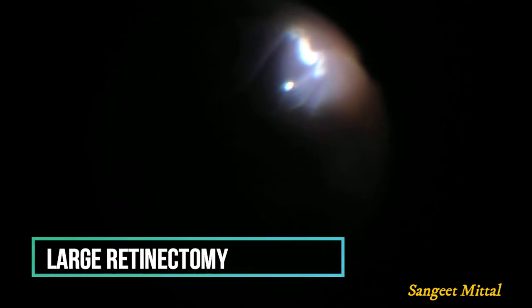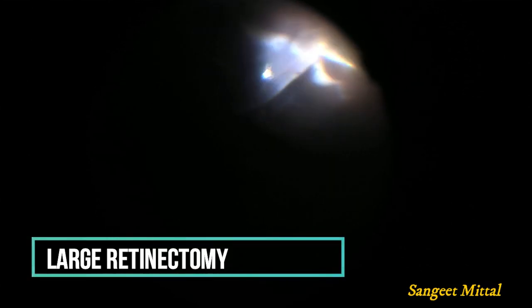If the subretinal fibrous tissue is more like a sheet rather than a band, then we need to create a large retinectomy to expose the undersurface of the retina. The subretinal band is then caught at one end and delaminated from the retina slowly. Once the whole band is separated, it can be removed.